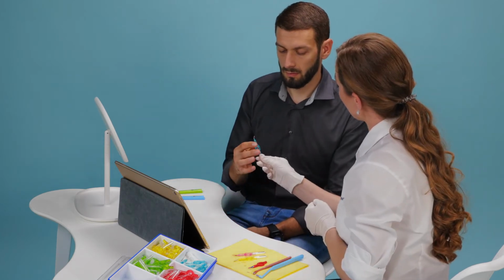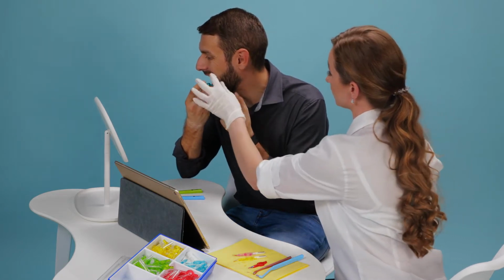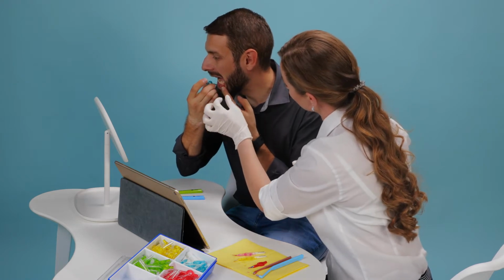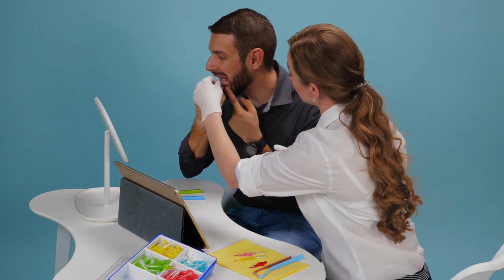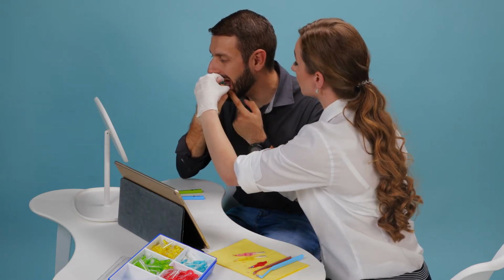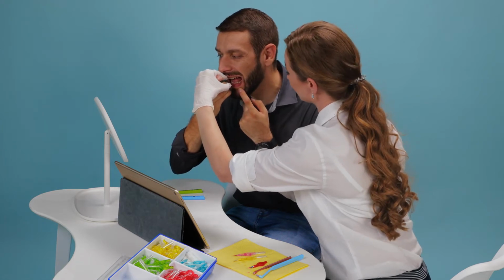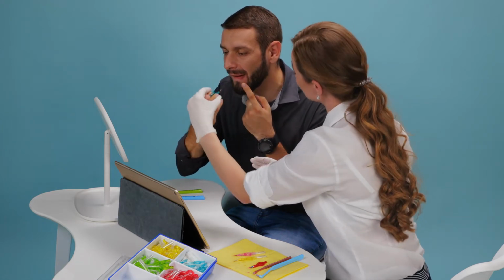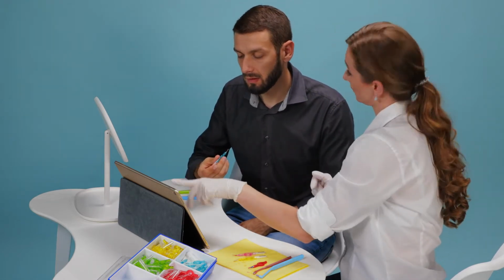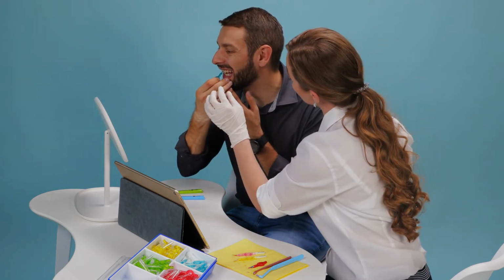I then begin the dental coaching with my patient by suggesting we begin with the smallest interdental brush and in an area that will feel easy for the patient when starting. In Edward's case, I have suggested the turquoise Prime interdental brush to be used on the lower anterior teeth. The reason why this routine is suggested is to help build upon the feeling of ease and success when using the interdental brush. This also gives the patient confidence when it comes to using the interdental brush later on at home.